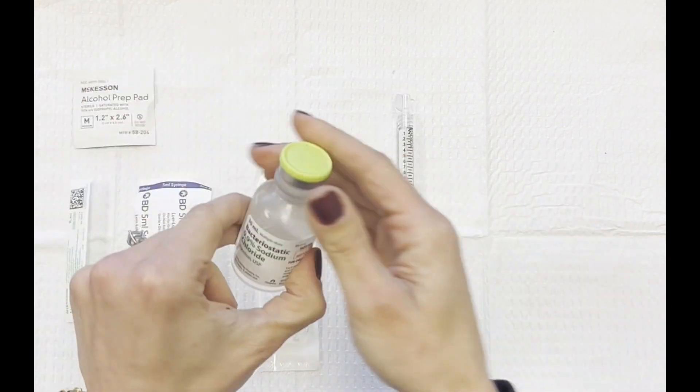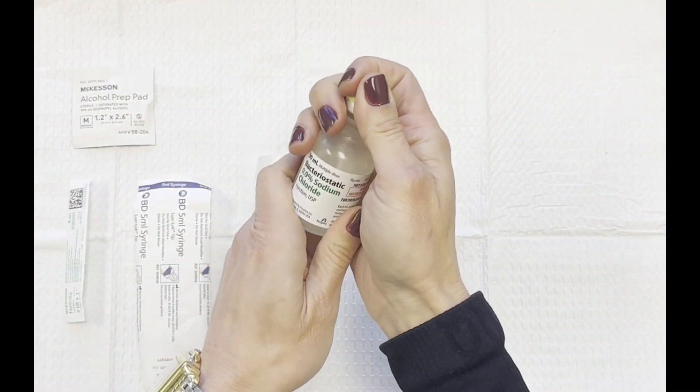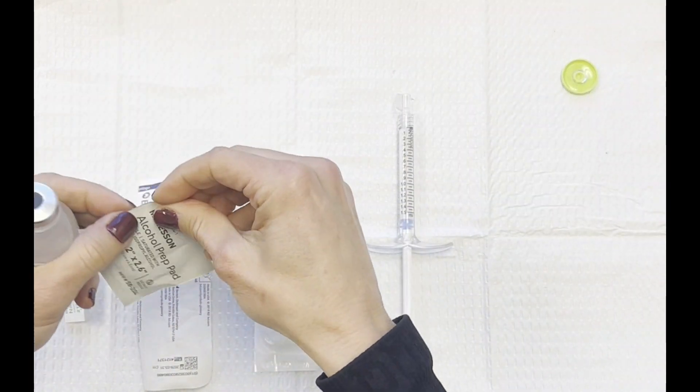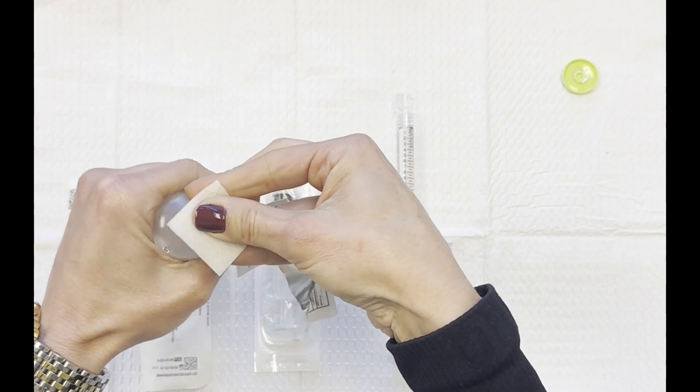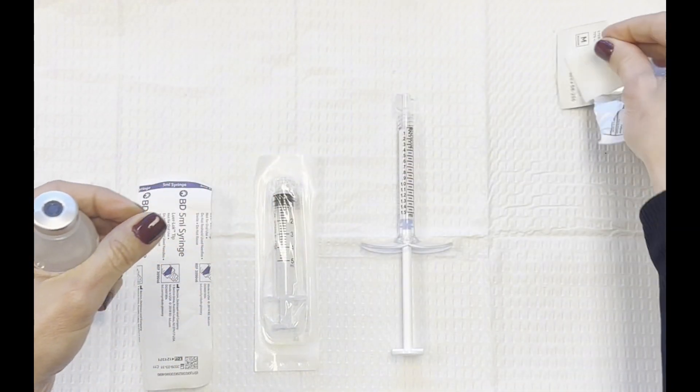I like to use either bacteriostatic normal saline or normal saline, whatever you have on hand. Clean the top as always, and I'm going to use a 21 gauge to draw up my normal saline.